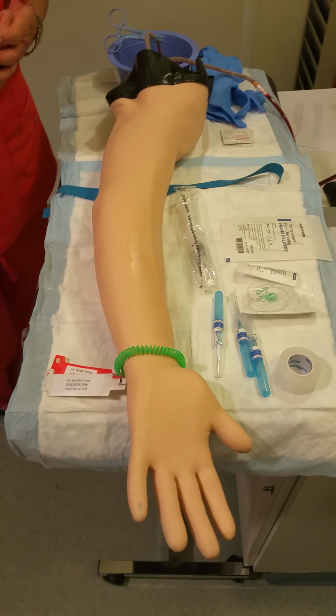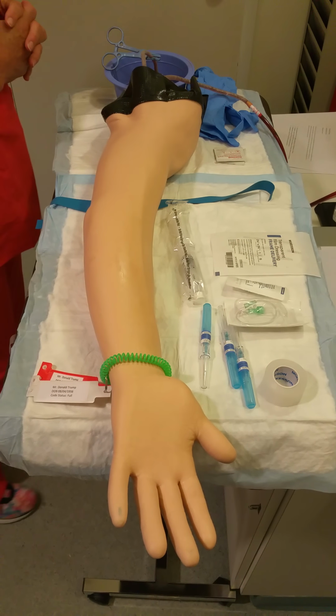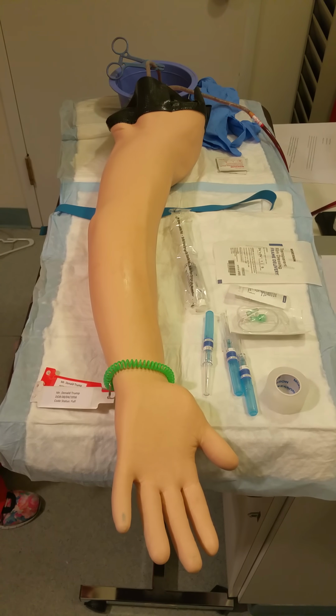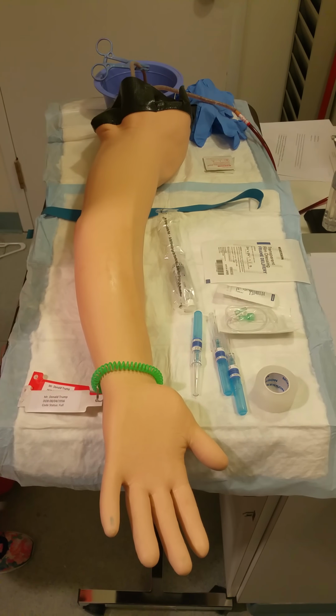Outside the room, I'm thinking about several things. Number one, his isolation status. Mr. Trump has no infectious disease. The only PPE I need are the exam gloves, which are in the room. He's been cooperative. I shouldn't need any assistance.